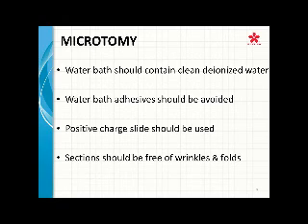Positively charged slides should be used. Make sure you have a quality positively charged slide. I've seen non-quality positively charged slides being used in immunohistochemistry, and I can tell you from experience that can also affect the quality of immunohistochemistry staining, especially if you're having issues within your laboratory.